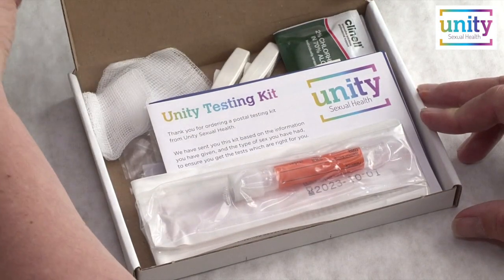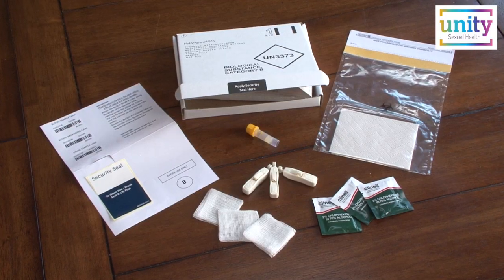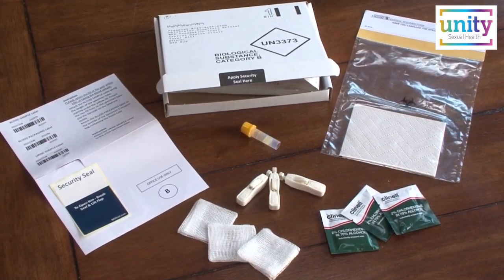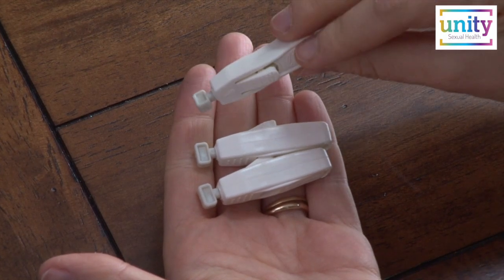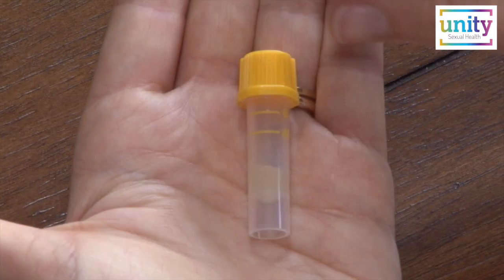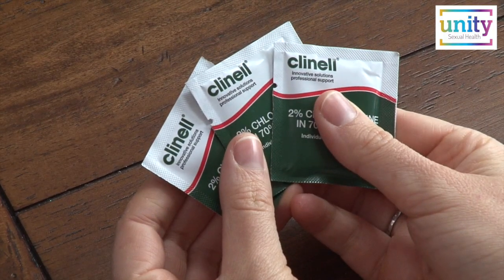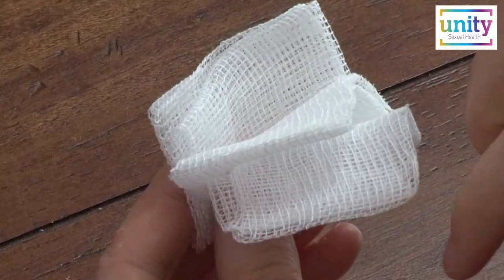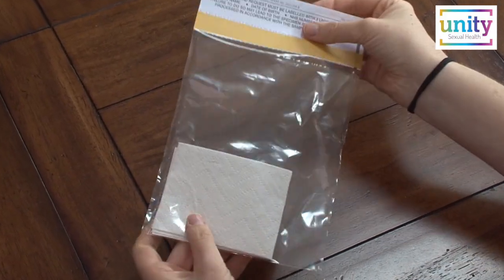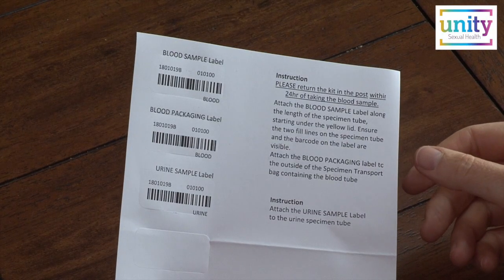Here is how your kit might look. We suggest that you unpack all items in the pack and place them to one side. To help you provide a blood sample there will be 3 lancets, 1 blood specimen tube, alcohol wipes, fabric gauze squares, 1 clear transport bag with an absorbent pad, and 1 blood sample label sheet.